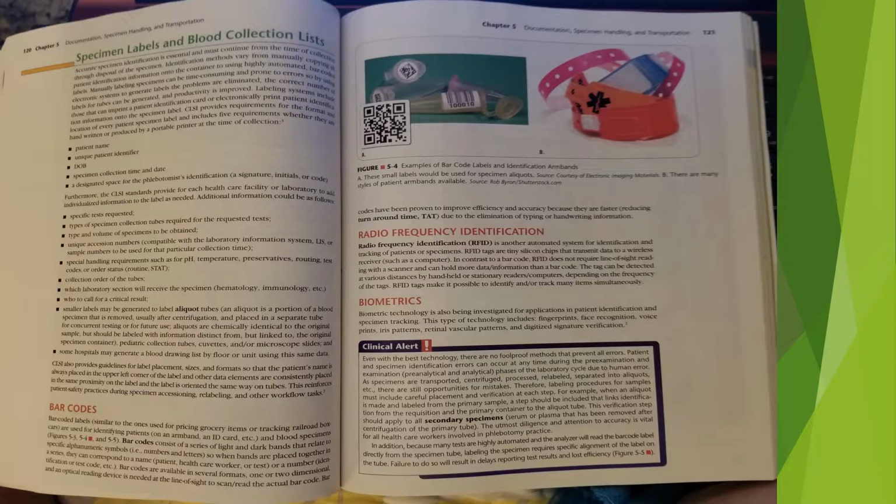Smaller labels may be generated to label aliquot tubes. An aliquot is a portion of a blood specimen that is removed, usually after centrifugation, and placed in a separate tube for concurrent testing or for future use. Aliquots are chemically identical to the original sample but should be labeled with information distinct from but linked to the original specimen container. Pediatric collection tubes, cuvettes, and/or microscopic slides, and some hospitals may generate a blood drawing list by floor or unit using the same data.